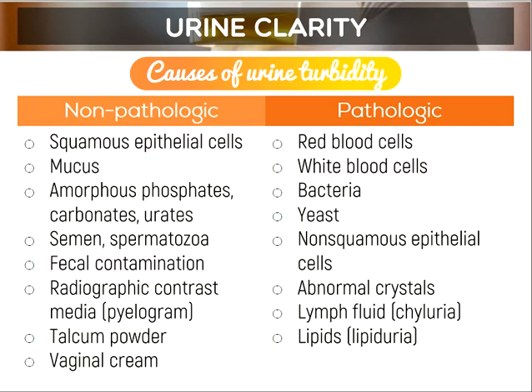Compared to the non-pathologic: phosphates, carbonates, urates, spermatozoa, radiographic contrast media, pyelogram.